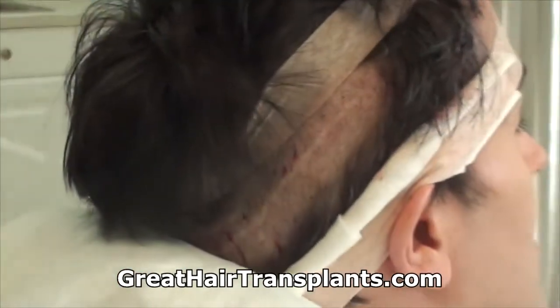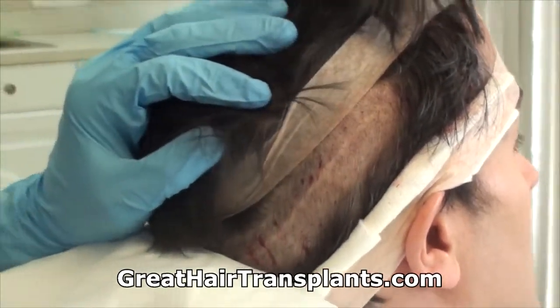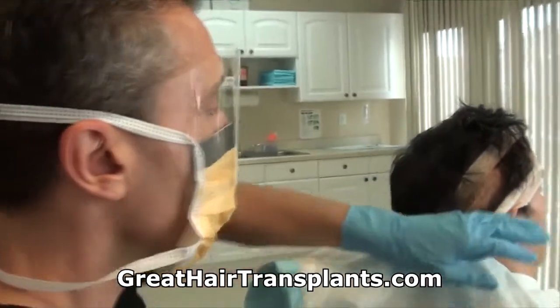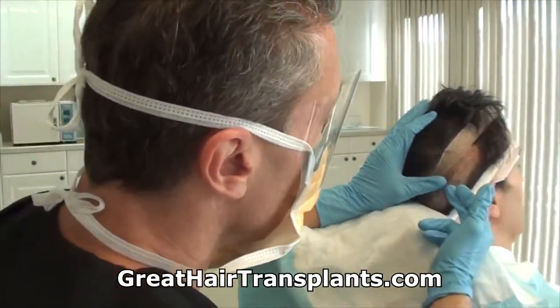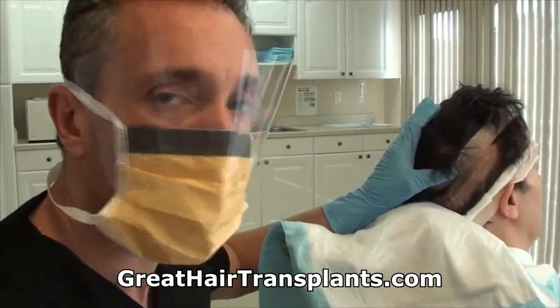Now Jeff's a good sport. He's going to allow us to do a follicular unit extraction on him just to show the camera, but then we're going to do a strip surgery. So we're just going to show you what the process is of doing that follicular unit extraction so you can see what happens to those grafts.